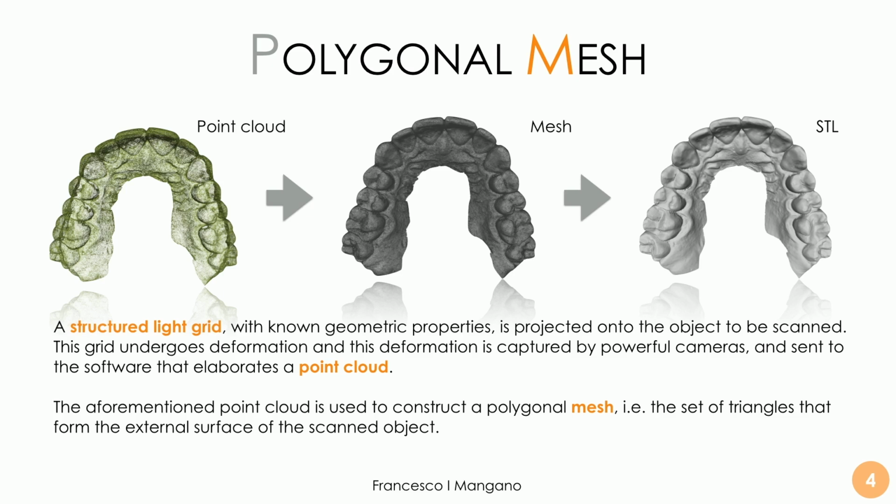The cameras are usually very powerful. They have a high resolution of acquisition, but they are not the only determinant. They are not the only key factor in determining the resolution of acquisition of a model, because then the software comes. The software is the brain.